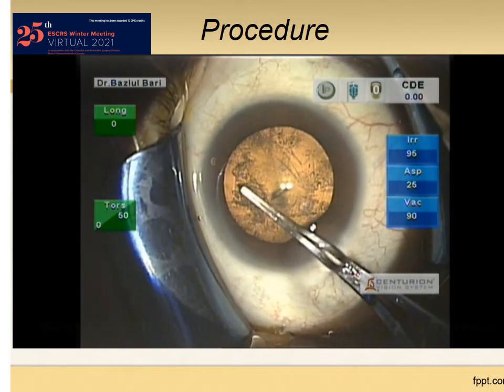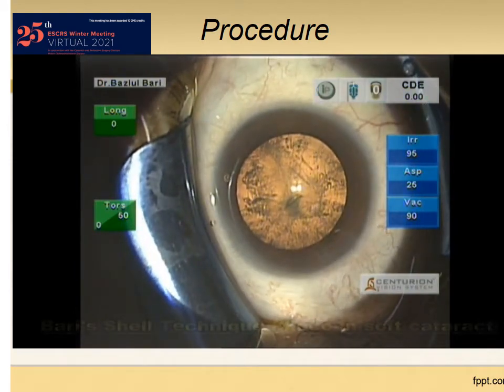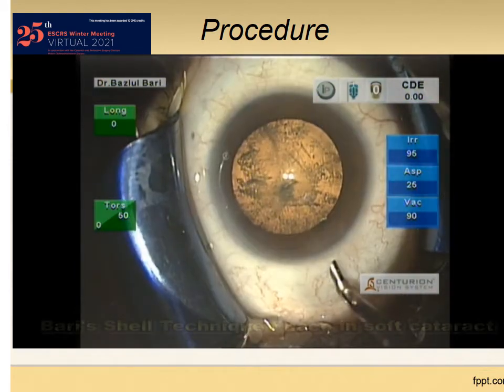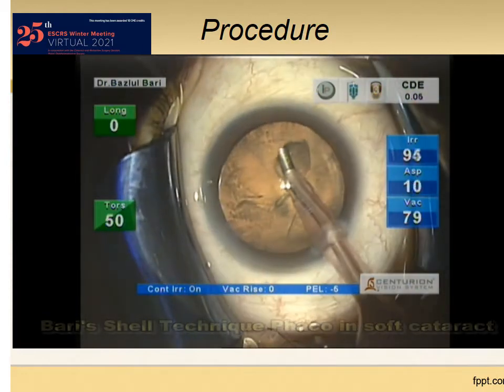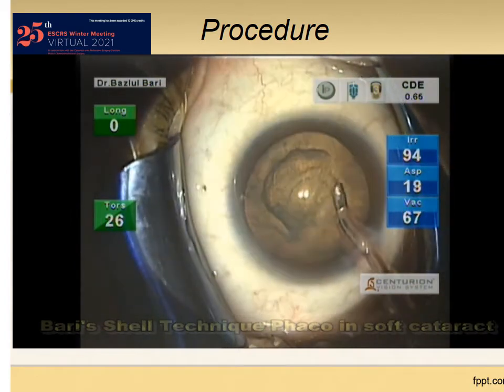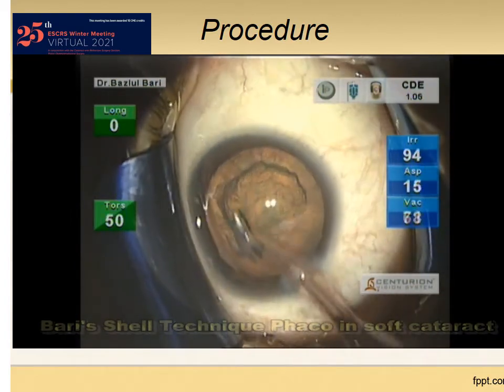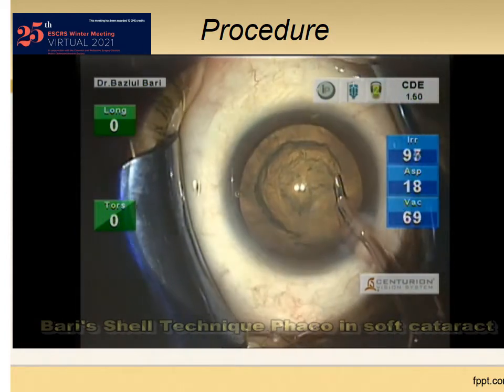Just after capsulorhexis, commonly we go for the hydro procedure. But in my technique, I am going to clean the anterior cortex and epinucleus in a circumferential manner following the rhexis margin, keeping the FACO tip in bevel-down position.